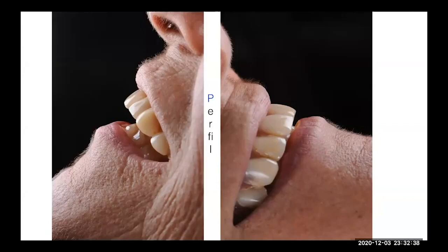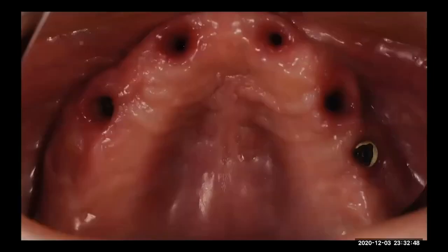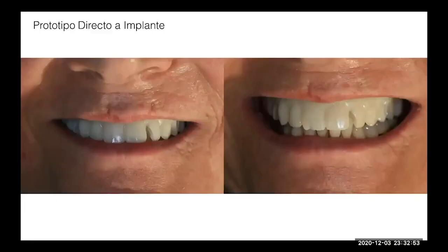This is something really, really important. We can apply the technique in different ways. So this is the way that we received this patient. He did the impression directly to the implant. And we normally do, for this kind of case, a prototype. We do a prototype because we want to know where we need to go. So in that prototype, we can show the patient and the doctor that we need to use some components that bring the angulation a little bit lingual, like a multi-unit.